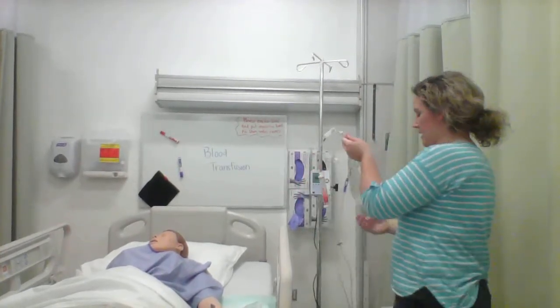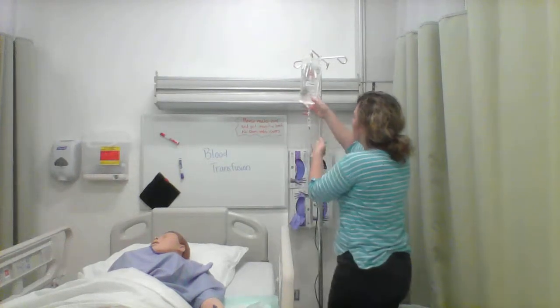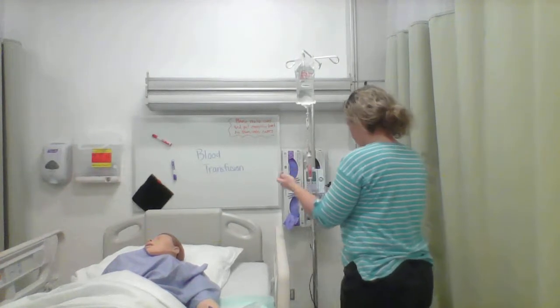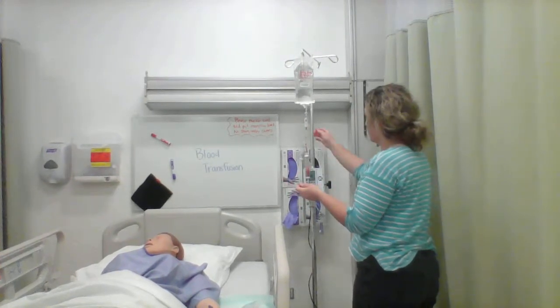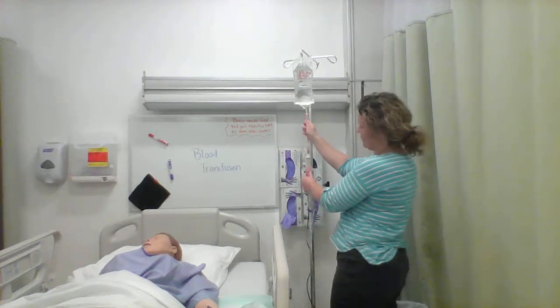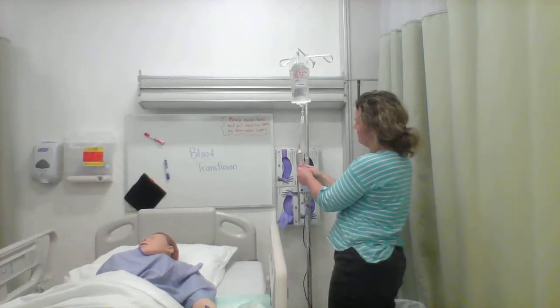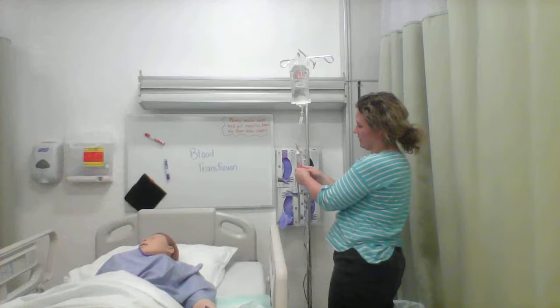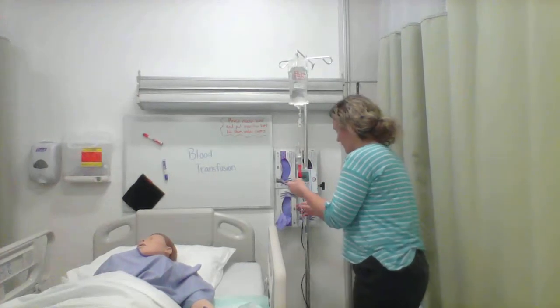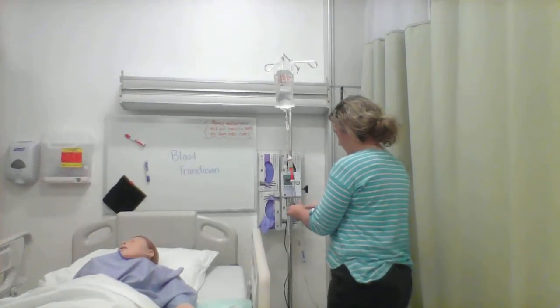Okay, we're ready to hang. And we're going to prime the tubing. But this is sticky, so we're first going to fill this half full so that the red blood cells have a soft landing. Okay. And now that that's done, we're going to go ahead and prime it with the saline.